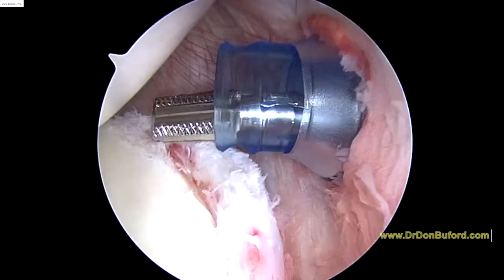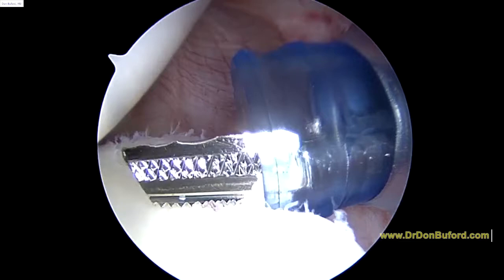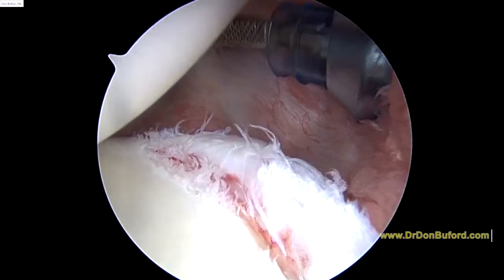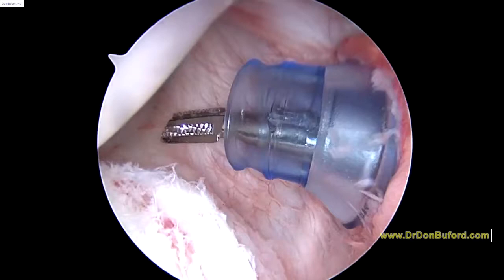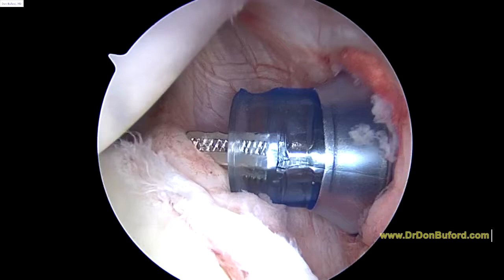Now we use this instrument if need be. I'm going to release the labrum, but I don't think I need to release anything here. We're going to use this rasp — it has some sharp points on it — and we're going to use this to roughen up the capsule here. The normal posterior band of the IGL runs right along here, and it's just not a very well-defined band right now. I'd like it to look more like that.